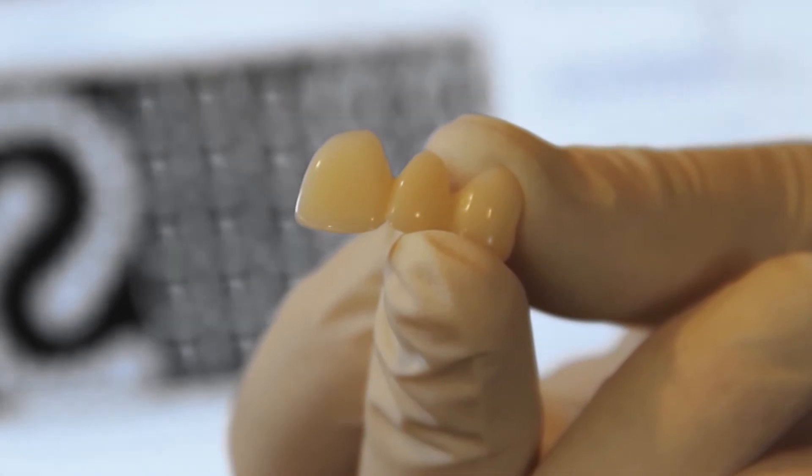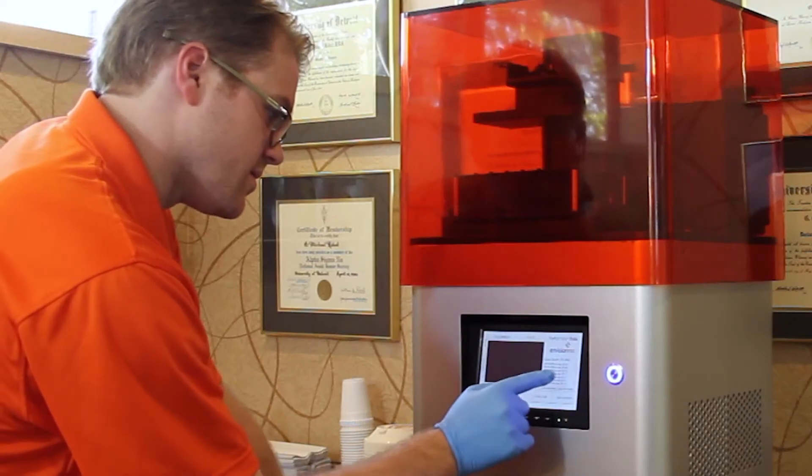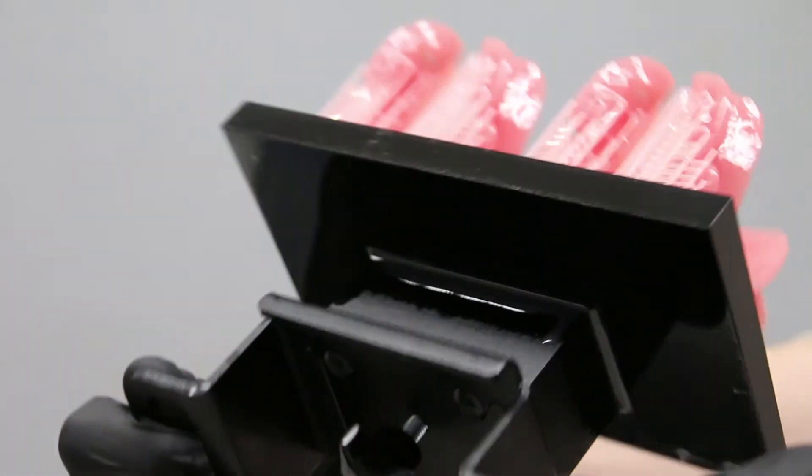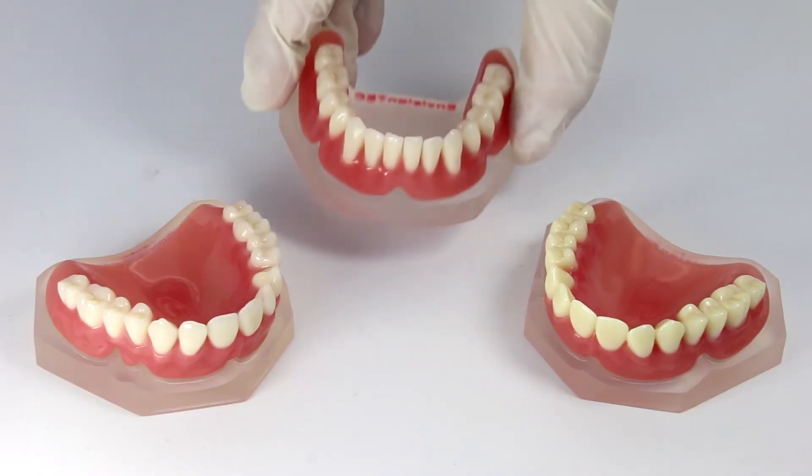Digital dentistry is a rapidly evolving field. And as such, the ideal 3D printing company must have an outstanding R&D team that will never stop pursuing the next innovation. As the president of DEN Core, I believe EnvisionTEC printers produce the best quality for dental applications.